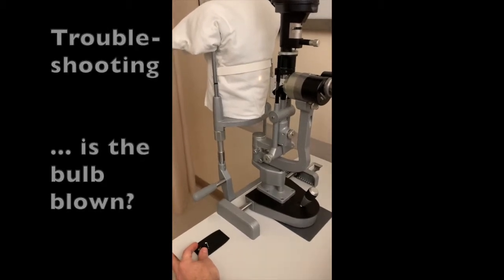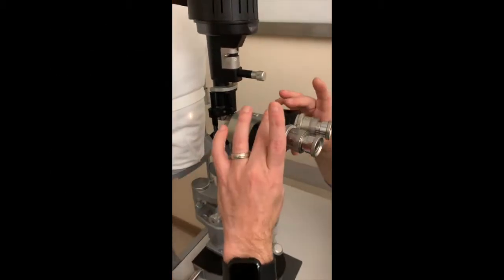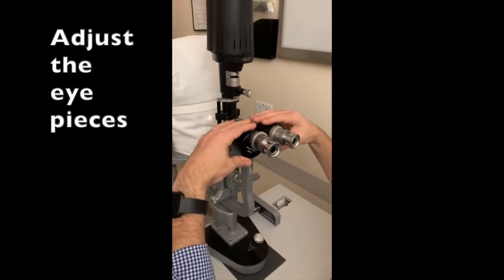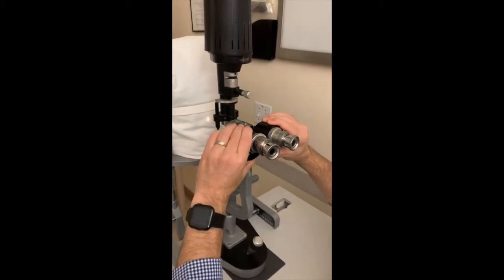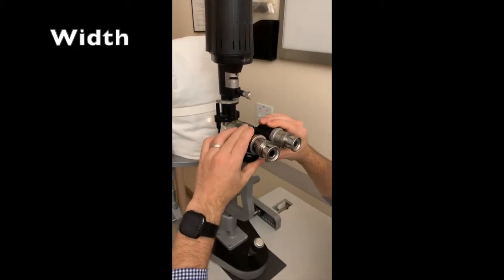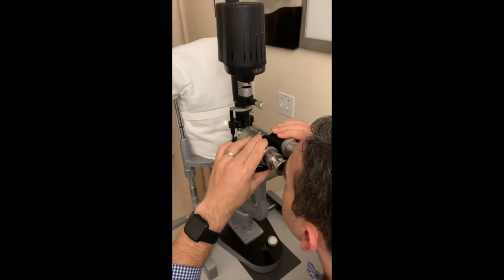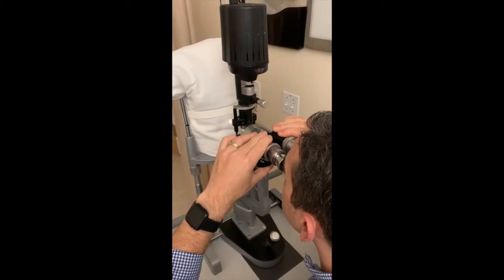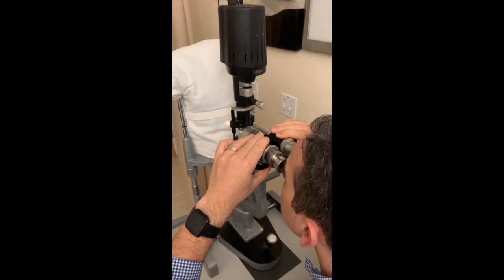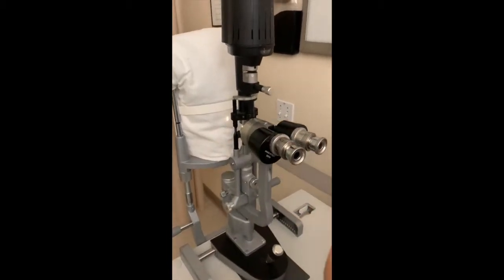The next thing you're going to do is adjust your eyepieces. So there's two adjustments. The first one is the width, which you just have to set to the correct width for your eyes. If they're not set to the correct width, then you're not going to get a three-dimensional view. You'll just be seeing with one eye, or you'll be seeing a split image.